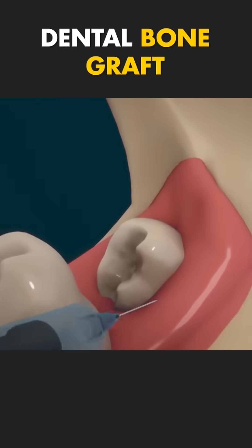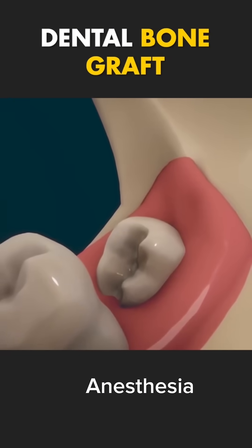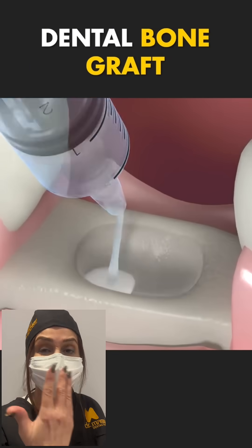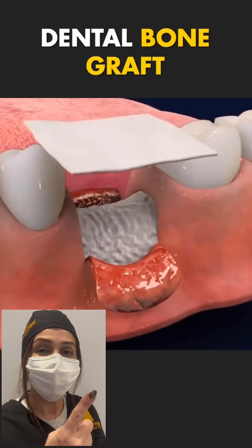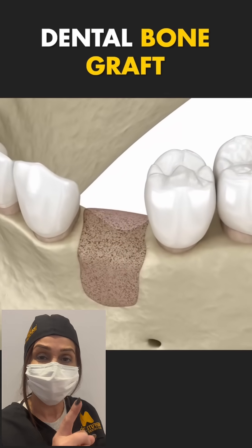Step 1: Your dentist or oral surgeon will start by numbing the area with anesthesia. Step 2: They place the grafting material, which can be from your own body, a donor, or synthetic. This material acts like a scaffold for new bone growth.